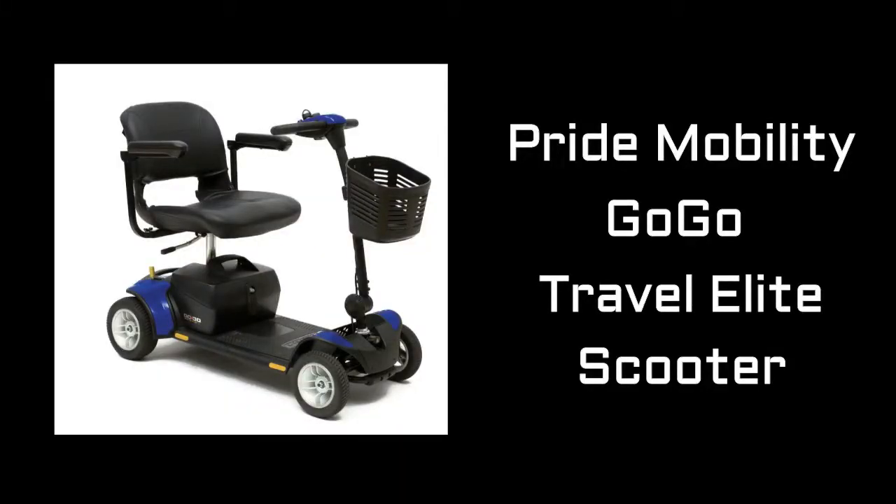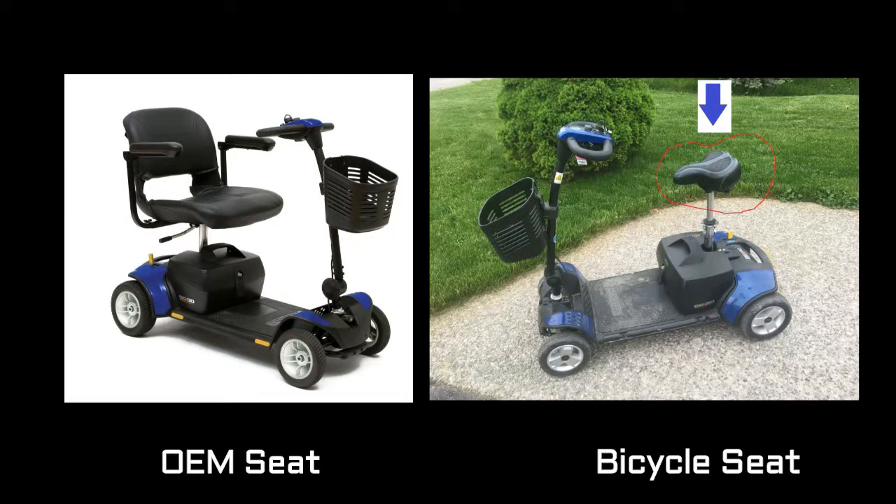This is the GoGo Travel Elite mobility scooter by Pride Mobility. It is an excellent product — it's the second one we've owned. What makes it unique is it is very lightweight and easy to take apart. We can actually pack it in the back seat of a sedan, and we take it with us on airplane trips, so it's been very useful. However, we found the original equipment seat to be kind of big and awkward, and my son didn't need that level of support, so we retrofitted it with a bicycle seat.